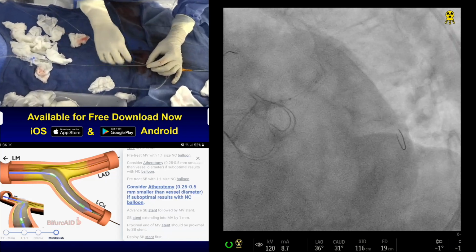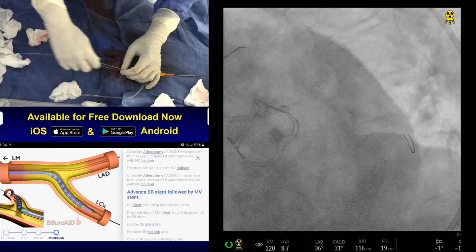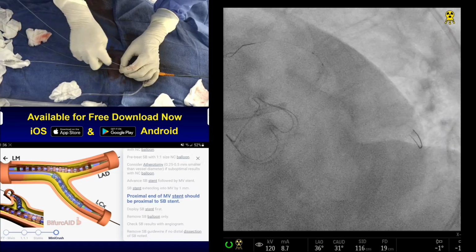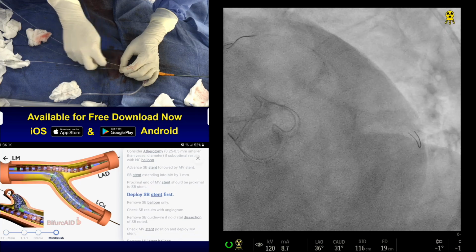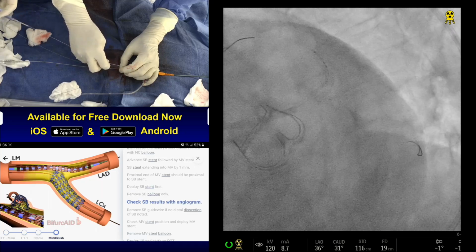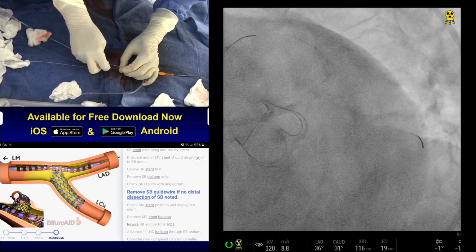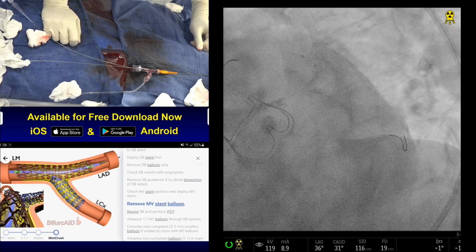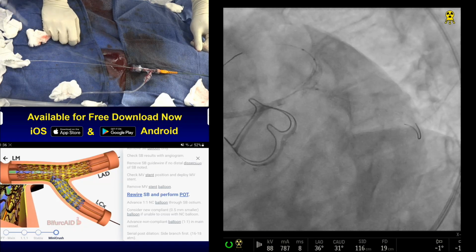Advance the balloon. Dr. Sharma, this is Dr. Rishi Sethi from Lucknow. Yes. Just one query. Don't you think that since we have pushed the entire circumflex stent away from the carina, then going a little proximally while crossing the wire would throw a little more metal towards the carina? Very good point. So let's see that if we are going to enlarge it, and we'll show you that a wire is exactly in the center.